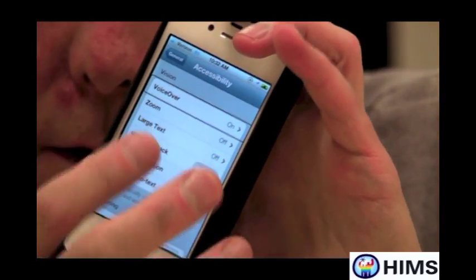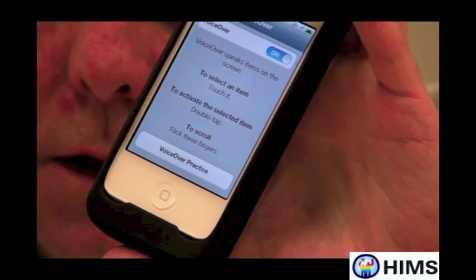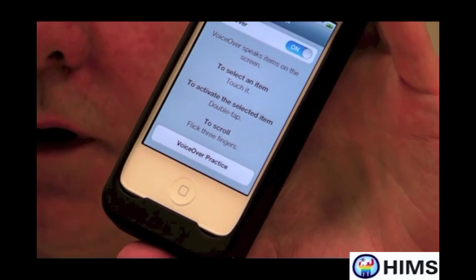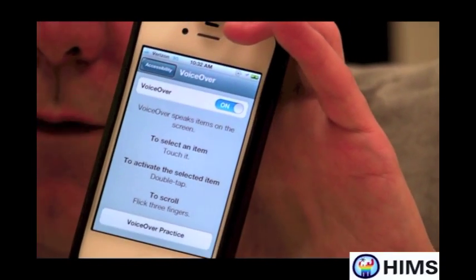Let's do that — double tap on VoiceOver on. There are a lot of good things under VoiceOver, but right now we need to find something called Braille. That happens to also be near the bottom of the screen, so I'm going to take my four fingers and go to the very bottom of the screen.